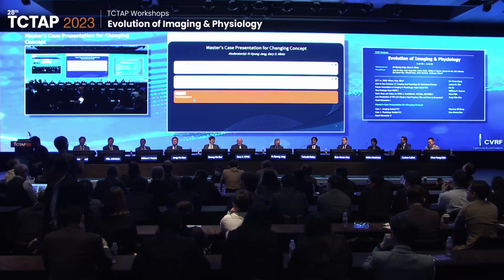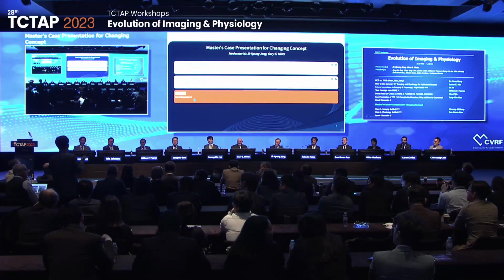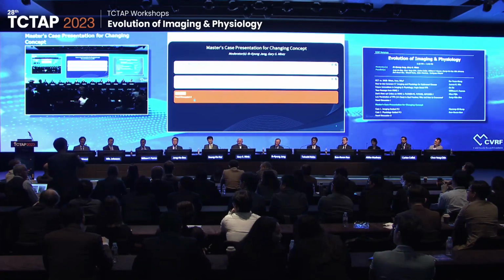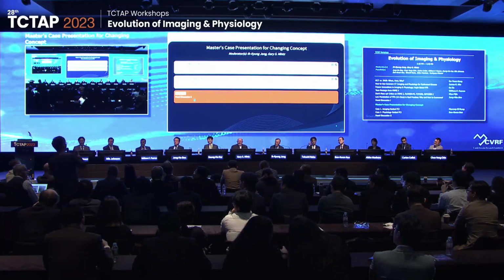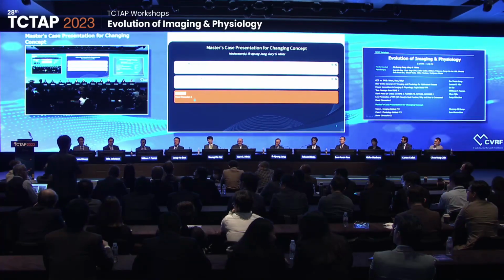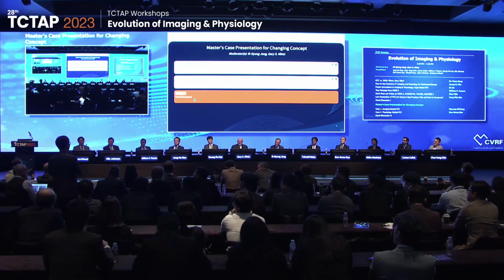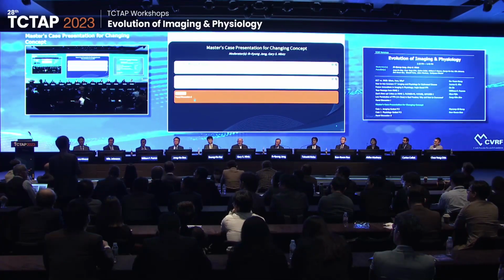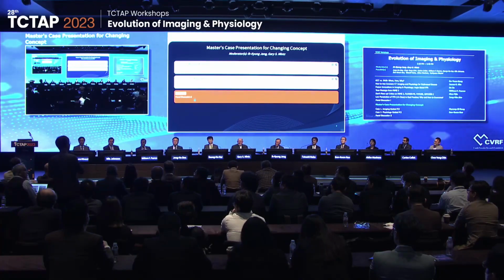What I mean is the 10, 15 years of experience. In the beginning and 15 years later, the expert looks at the angiogram. For others, we have a treadmill test and the symptoms, and for the very tight narrowing, we do not do the pressure wire in that case, just deploy it, that's it.